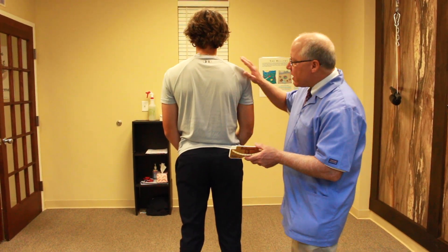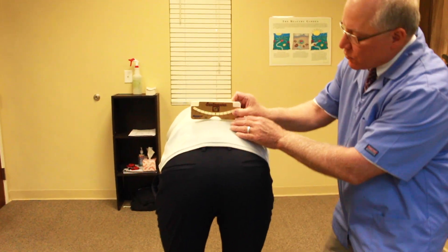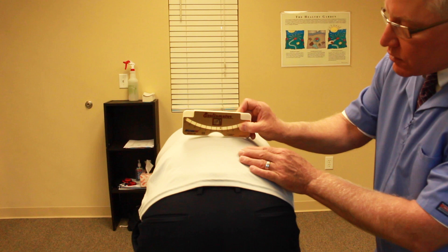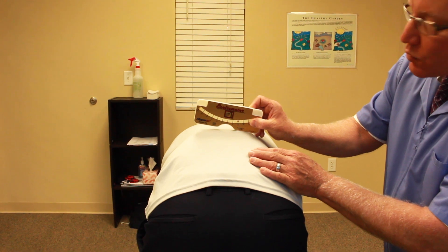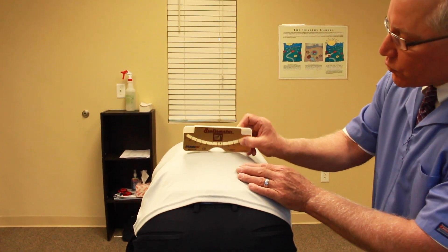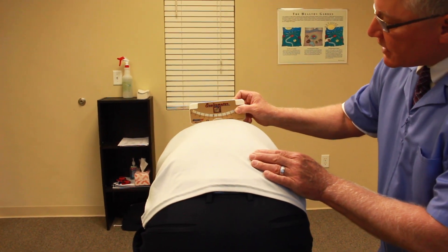Go ahead and bend forward and we're going to show them how it works. As the scolimeter goes along, you can see that it tilts. So if it tilts seven degrees, then that equates to 20 degrees on an x-ray. And we'll check L3, T12, and also T7.